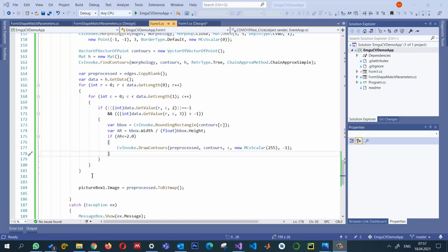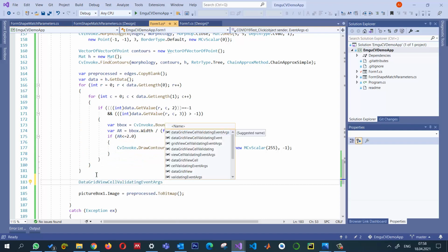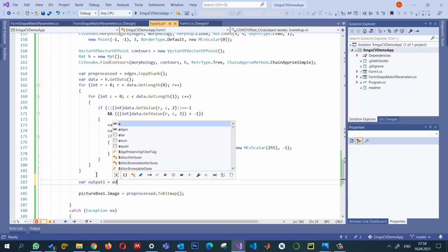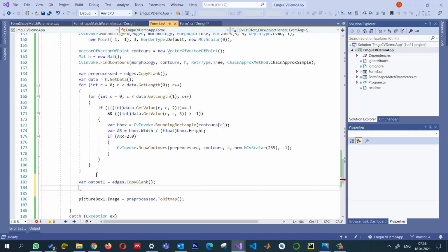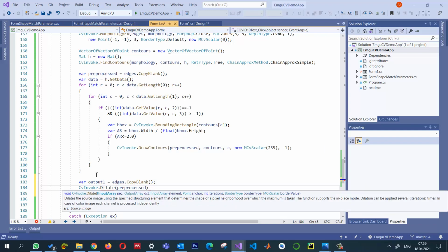So once we have, let me create another variable. Let's say output1 is equal to, we can do the same thing, edge.CopyBlank. So I just created a blank version with the same size, but all these will be set to 0. So let us apply the dilation. CvInvoke.Dilate, and here we will provide the pre-processed image as input. Okay, and the output will be output1.